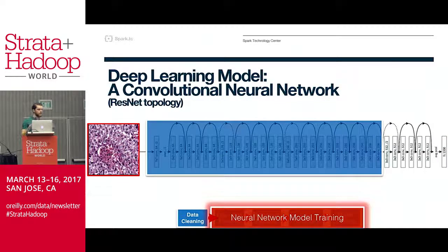But after that, we're using pre-trained models because we're making the assumption that a model trained on some image classification tasks will learn at least lower and mid-level features that are applicable to lots of image tasks, such as edges and shapes and other such things. But high-level features may be more related to the actual classification task that it was trained on. So the higher level features may be more related to cats and dogs and birds for ImageNet.